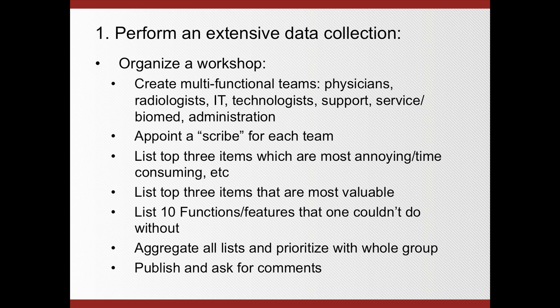Then, after you do the top 3, let's say worst and the top 3 best, then you want to list features that you absolutely could not do without. For example, annotation, or the right template for speech recognition, or the use of templates with speech, with reporting. Features that are absolutely needed, that are absolutely, say, this is critical to my operation.